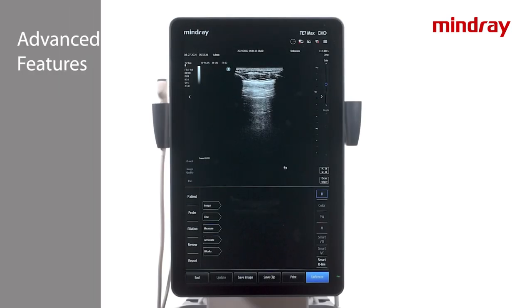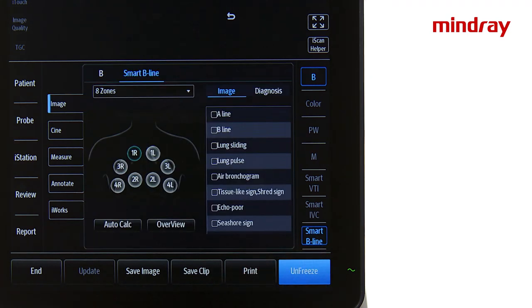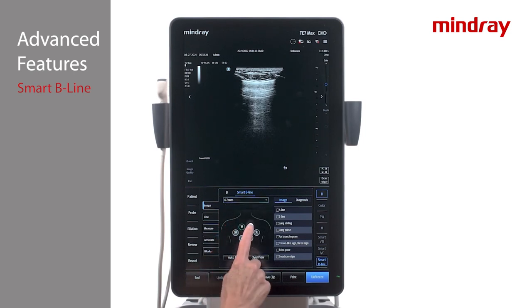Smart Beeline is an AI tool which will identify the pleural line and provide quantitative analysis of B-lines, as well as provide lung scores. Select the desired transducer and lung exam mode. The Smart Beeline function may be performed during live scanning or from a stored clip. Tap Smart Beeline to activate and select the desired lung map and zone. Obtain an image and select Auto-Calc to start analysis, then press Freeze and Save Image to display results. The system automatically detects the rib acoustic shadow and analyzes and calculates the B-line number, distance, percentage, score, and also automatically displays the image with the largest percentage.